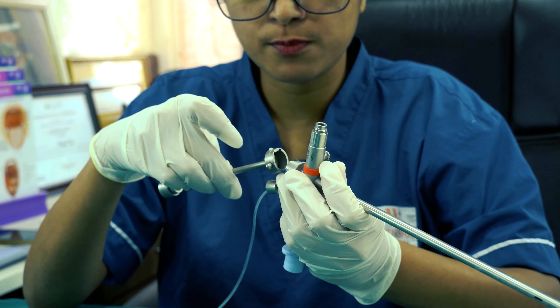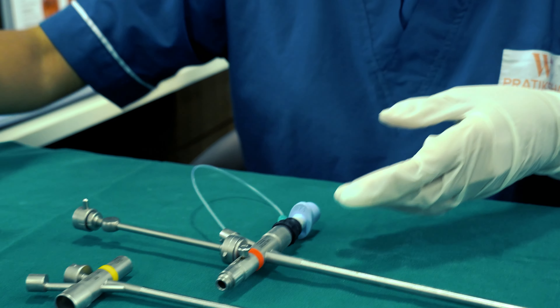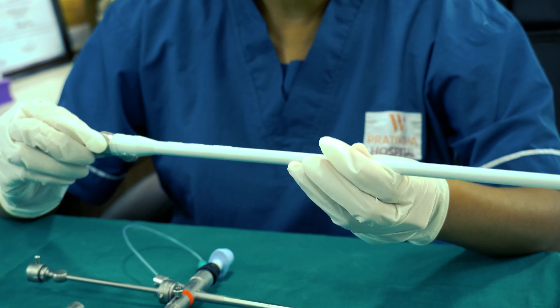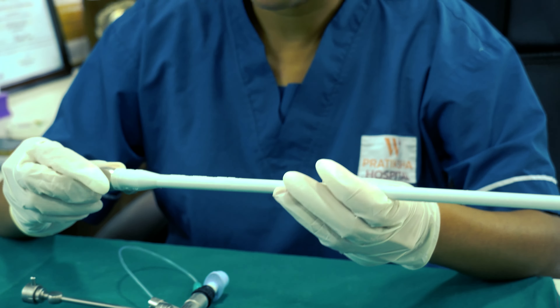Now for the telescopic rod lens we have to use another part of the assembly which is called the bridge. Here is the bridge. This end of the bridge connects to this port — we have to direct it this way with the smaller ridge on this side upwards, and directly connect it this way. Next, this will be directed sideways and just put it down here.